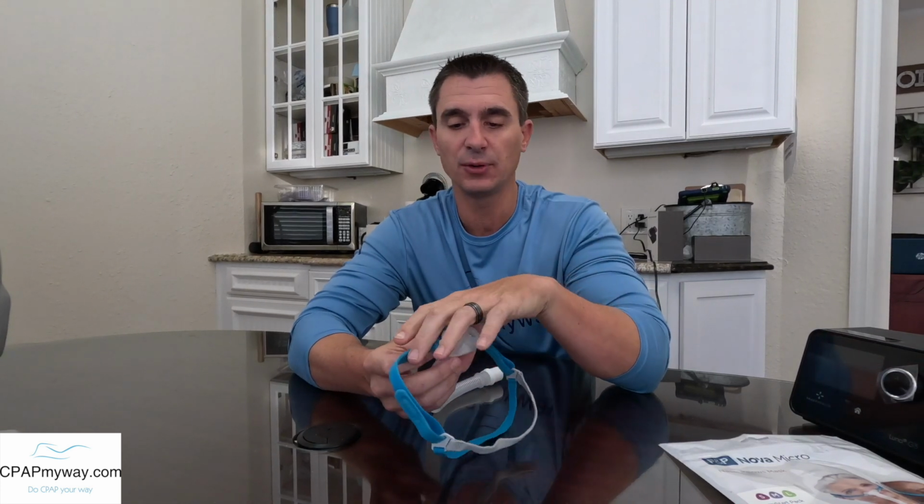So as a competitor of the P10, I think it's right up there with it. I think a lot of people that have had issues with all of the pressure being on the nostril, the nares of the nose, I think they call that, this might be a good option because it's going to spread that out a little bit. If you get this mask and you dislike the way it touches down below the nose, especially if it's rubbing up against your upper lip, then the P10 would probably be a better option for you because there's no touch there at all, really.